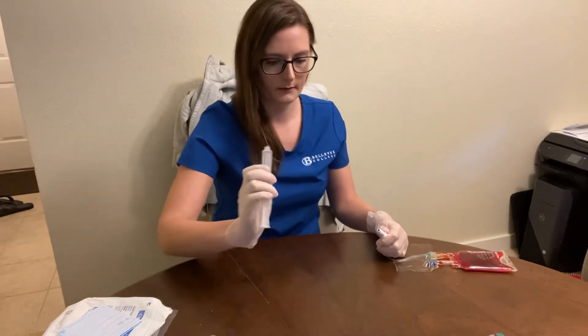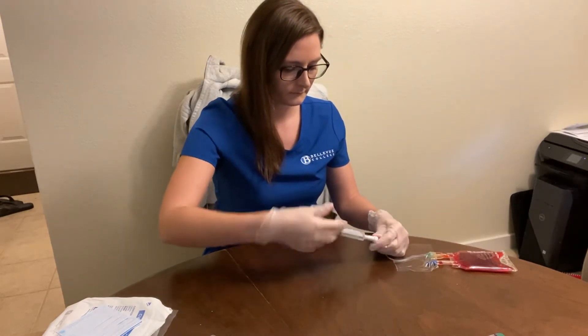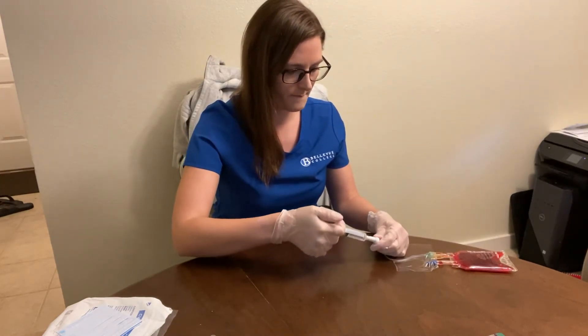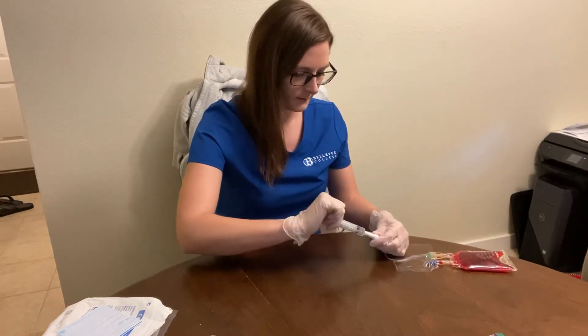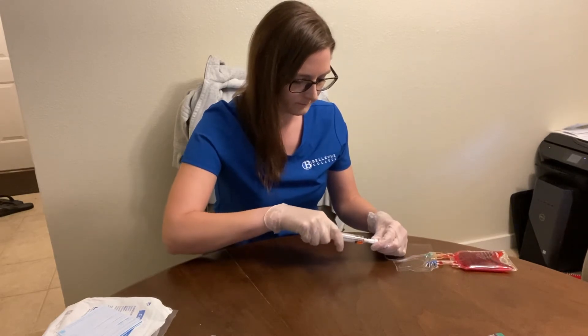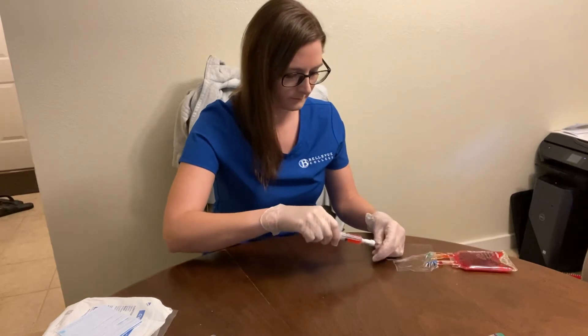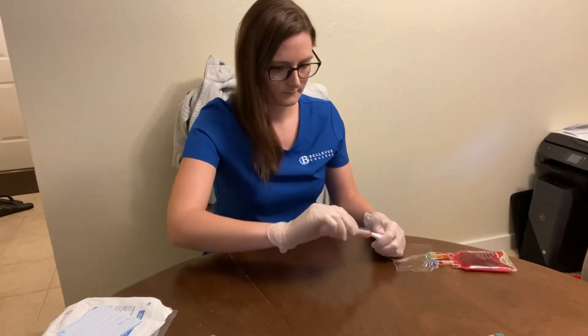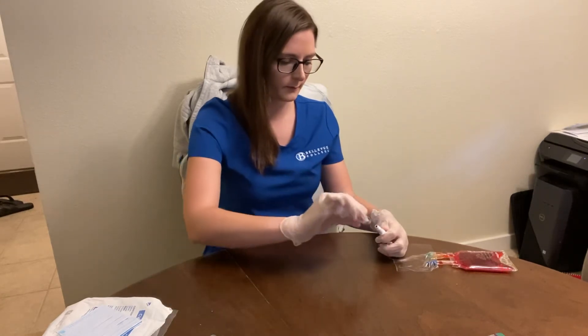Then I'm going to get my saline flush and pulse that through. I'm going to get my discard blood — about six ml — then discard that.